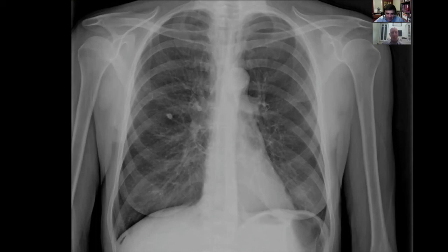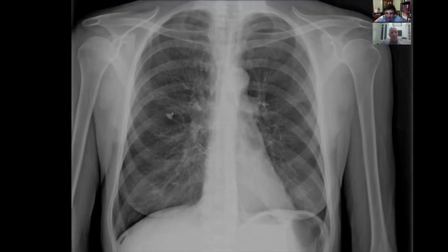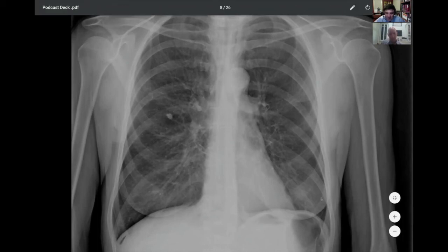And what you see in the lungs, as you said, is a little bit hyperinflated, nothing major here. There's a little calcified granuloma here. The interstitial markings are a little bit prominent, but I really wouldn't make much of that. This is some breast shadow bilaterally, no infiltrate there. You can see the heart border really well. When you look at the diaphragmatic borders, as you mentioned, there's just a sliver of lucency here.